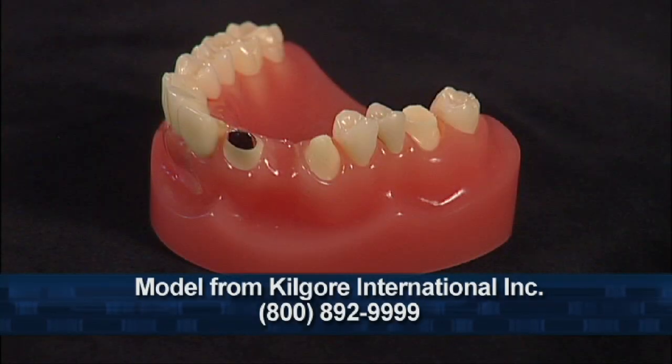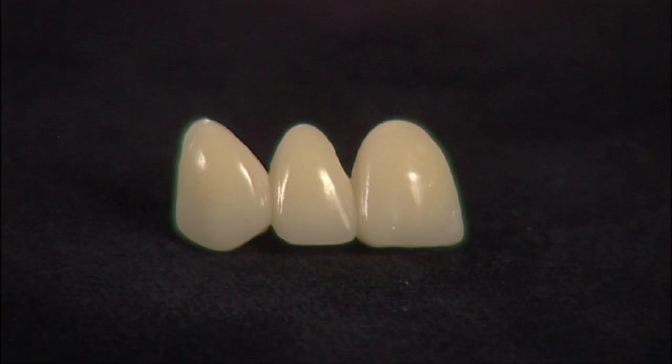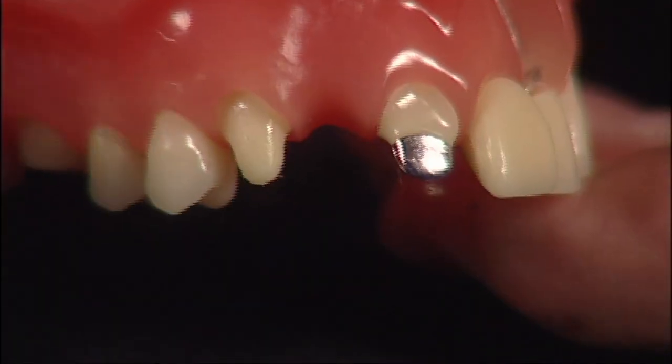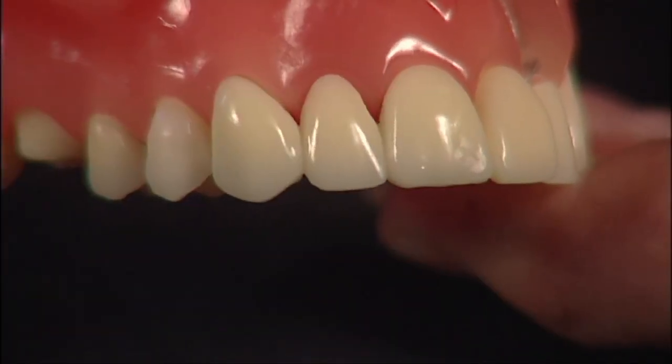The porcelain fused to metal fixed bridge is by far the most used form of fixed bridge in dentistry. The dental model you're observing has one missing tooth in the front part of the mouth. The teeth on each side have been prepared by the dentist for a fixed bridge. The piece of metal is a reinforcement of that tooth. The fixed bridge has ceramic fired onto metal on the inside of the bridge. Notice how the missing tooth is well replaced by the fixed bridge.